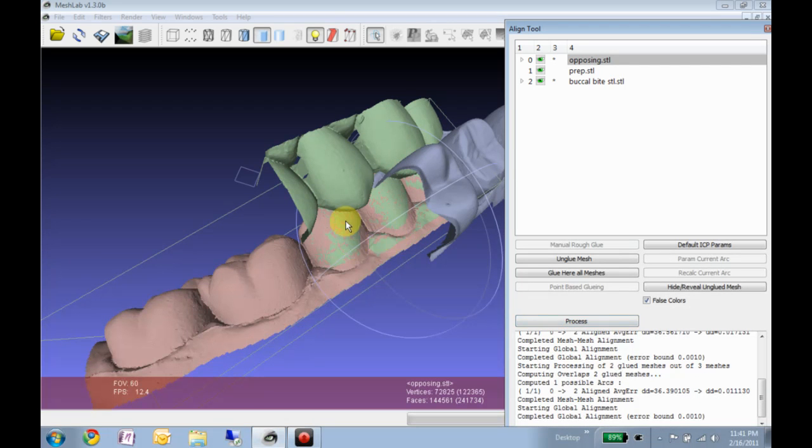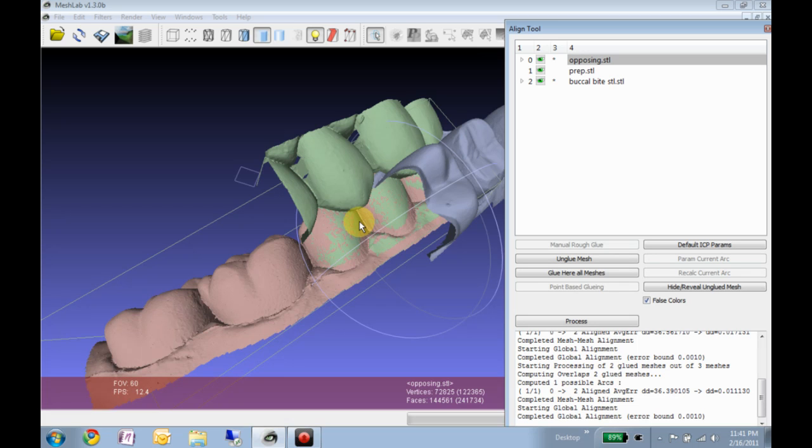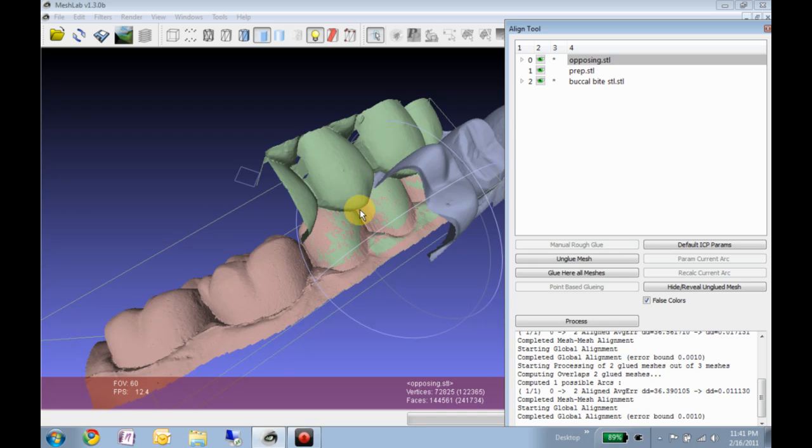So this is what we want to see, this speckling, because this essentially corresponds to two textured surfaces overlaying each other. The texture is the random noise in the detail of the scanner. And any time we see a line intersection, that's going to represent misalignment via some rotation or some translation or offset, and that's systematic error, not what we want.